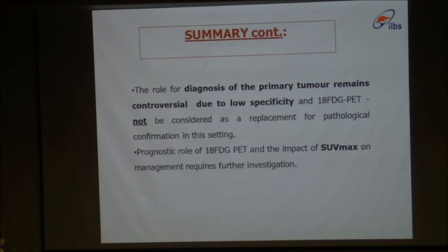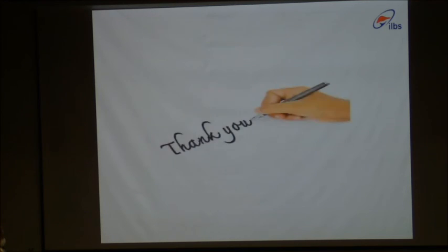The role in diagnosis of the primary tumor remains controversial due to low specificity. 18F-FDG is not to be considered a replacement for pathological confirmation in this setting. The prognostic role of FDG-PET and the impact of SUVmax on management require further investigation. Thank you, sir.